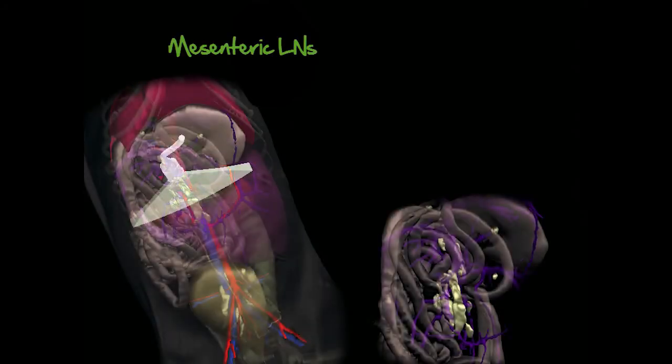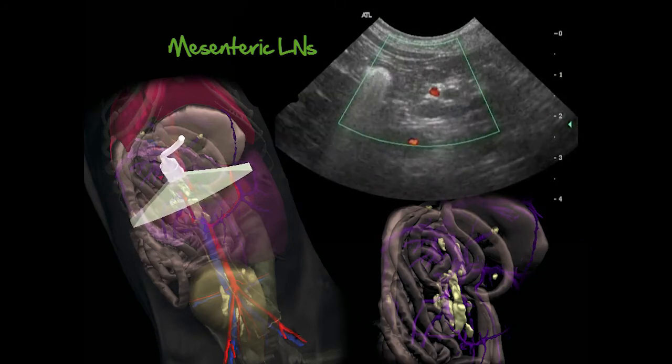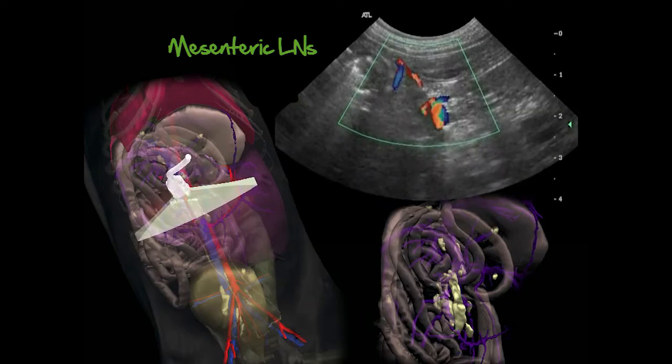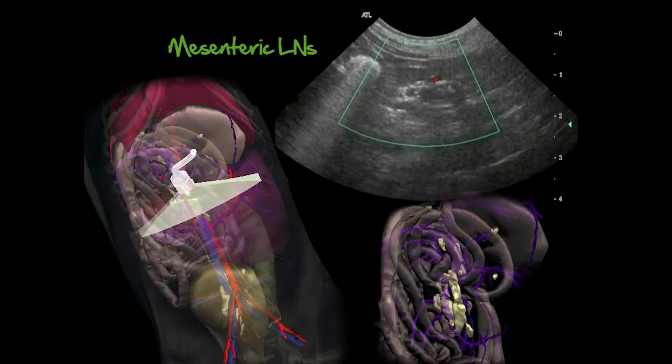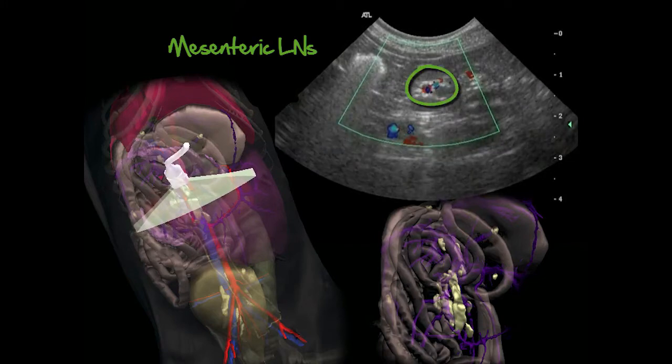A convex probe is often used to locate the mesenteric lymph nodes. These nodes can be identified by placing the probe transverse to the patient, immediately to the right of the umbilicus. Identification of the cranial mesenteric artery and vein, which make a winding path across the abdomen inside this transverse section, enables us to recognize the adjacent nodes.